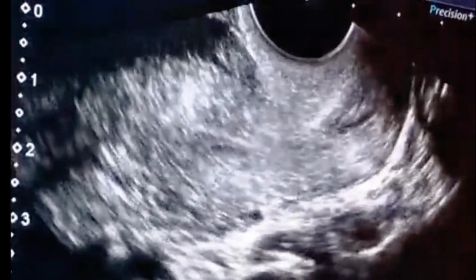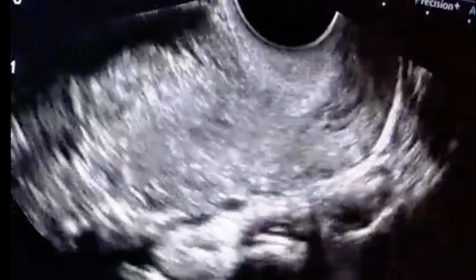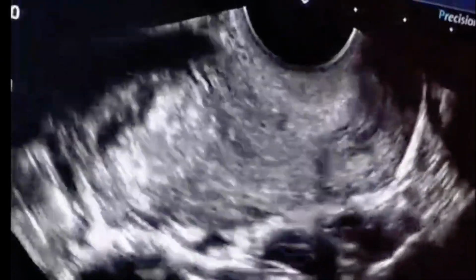Assalamu alaikum. Today we are performing a very informative and very important case for all the gynecologists and radiologists.